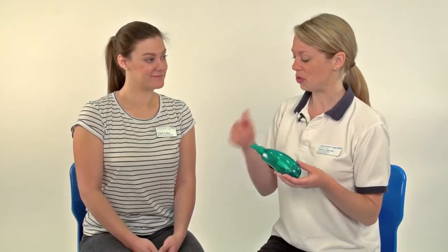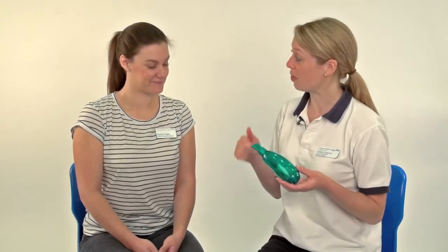The Acapella is something that you can only use when you're able to blow and breathe out through a mouthpiece. So if you're a baby then this wouldn't be a possibility, because you need to have a good seal around the mouthpiece.